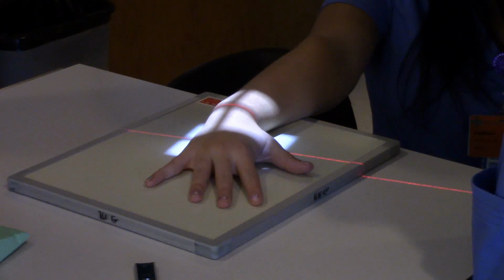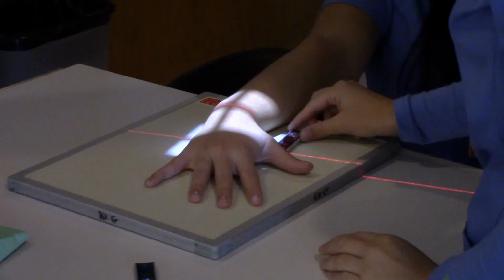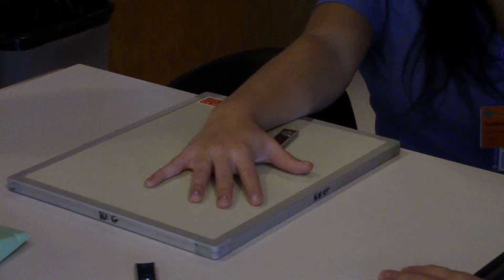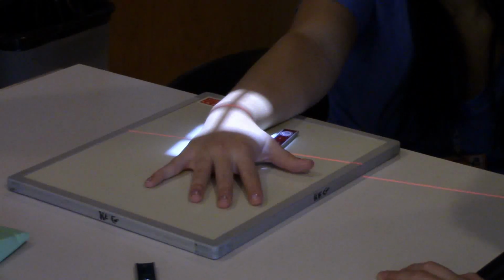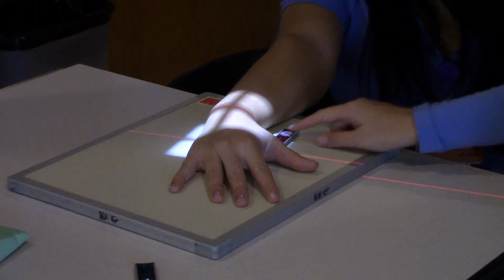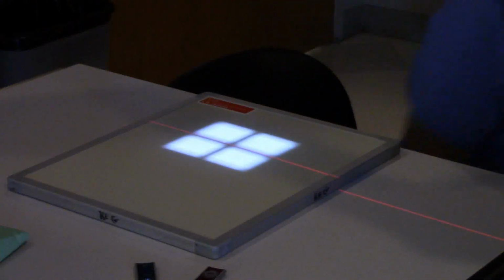This is going to deviate towards the radius. Okay, and now our centering point has changed. We're no longer going to be aiming specifically for the scaphoid. We're going to have our central ray approximately mid-carpal. Exactly, very good. All right, good job.